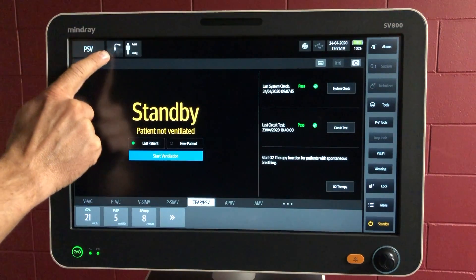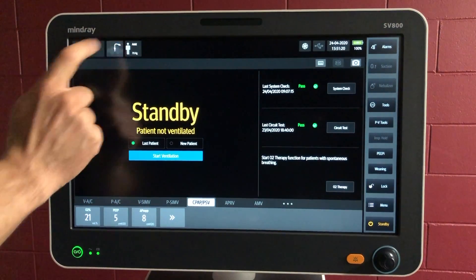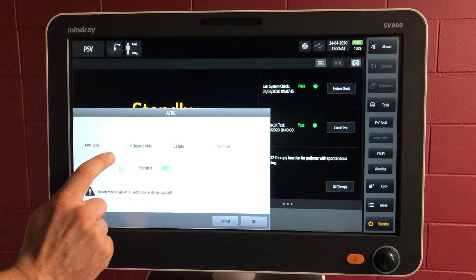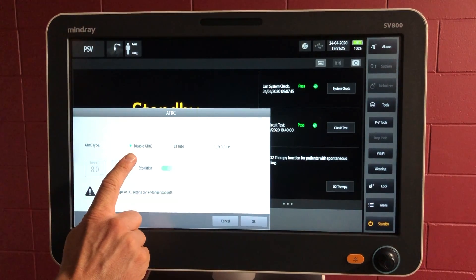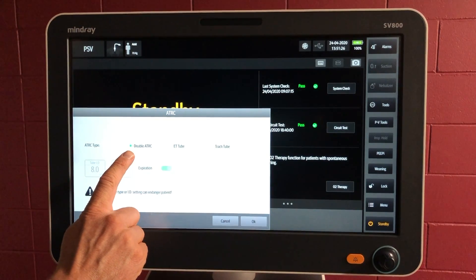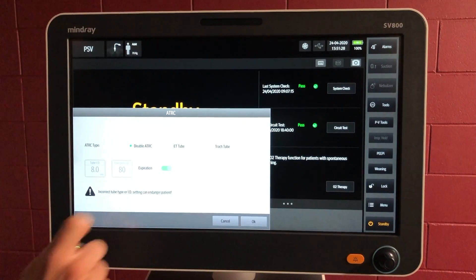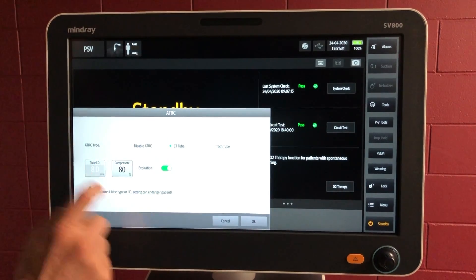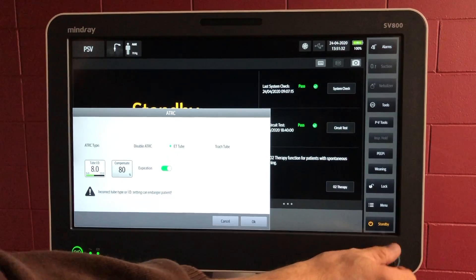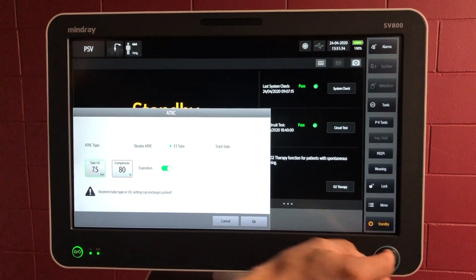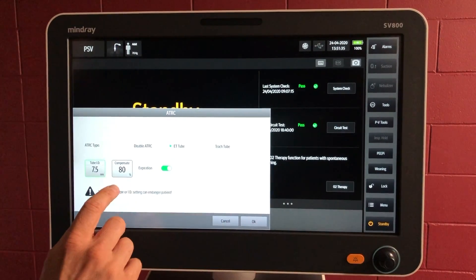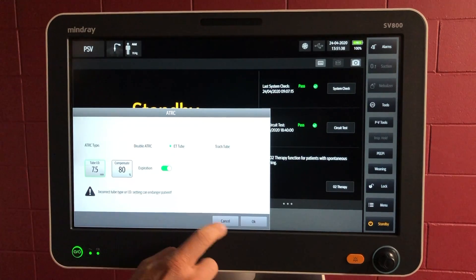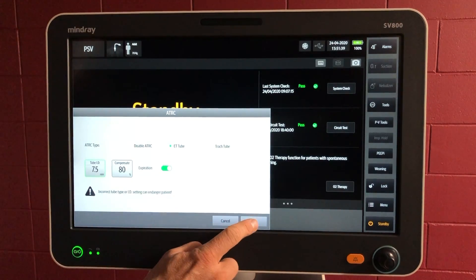With the tube here, if we touch that tube, the automatic tube resistance compensation — ATRC — is disabled by default. So let's choose an ET tube of 7.5, and there's also a tracheostomy tube option there as well. Push OK.